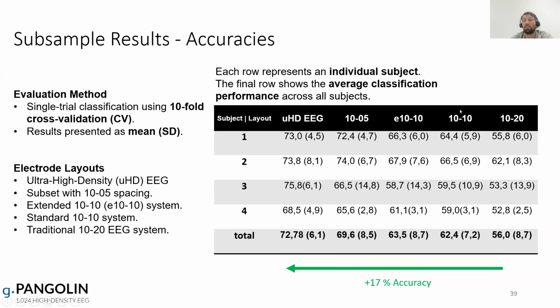And again, here we did accuracy calculations in the 4-class problem. And similarly, we achieved an improvement of the accuracy compared to also the motor decoding studies, where we saw a similar behavior.